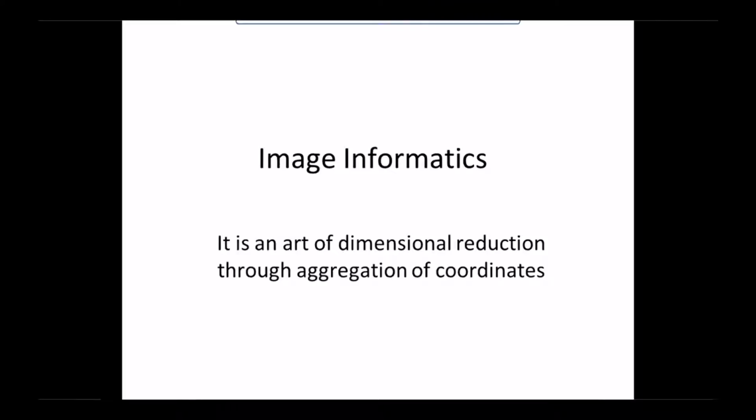The key part of it is to solve the curse of dimensionality, just like the current focus of all machine learning today, which is to go from millions and millions of dimensions to the important discriminating dimensions that are a finite number, maybe 1,000 dimensions. So we're going to show you a 1,000-dimensional reduction of the original multimodality images, which may have started at 10 million dimensions, and we reduce to maybe 1,000 dimensions. And those 1,000 dimensions are then searchable.